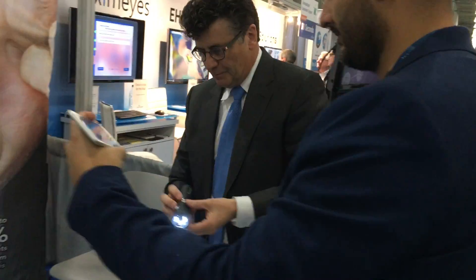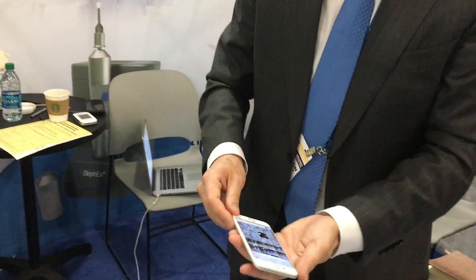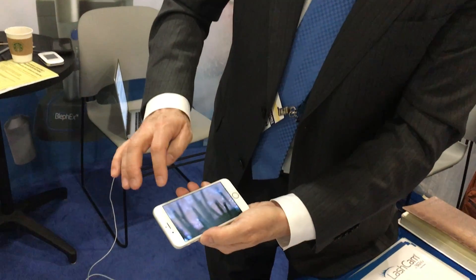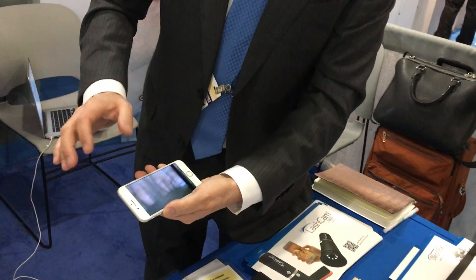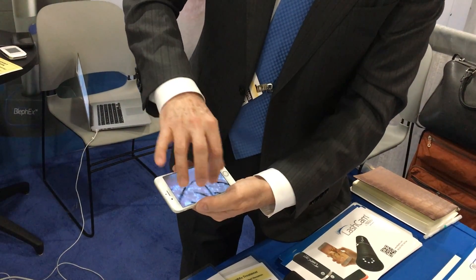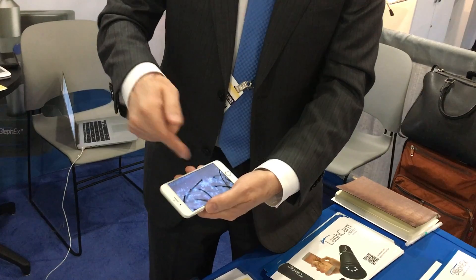Once you have all the pictures you want, go to your picture file on the device and review the pictures with the patient. Here are your upper lids — scroll until you find some that are nicely focused. What we're looking for is the biofilm, demodex — you can see demodex with this — and swelling around the lashes. That shiny, crinkly appearance is the biofilm. Your patients with heavy biofilm accumulation will produce a much more impressive picture.